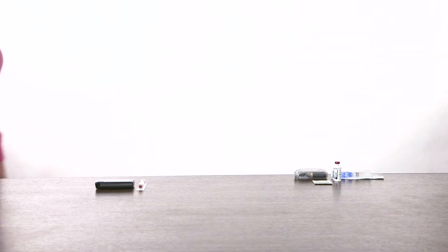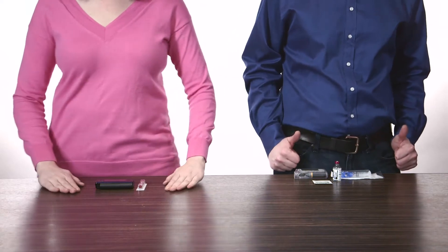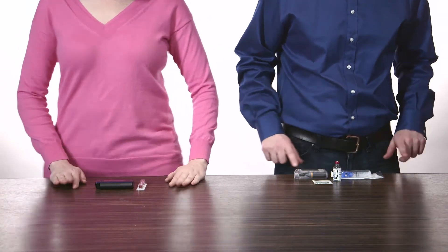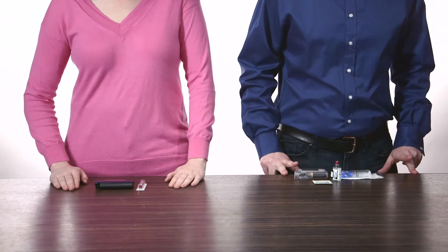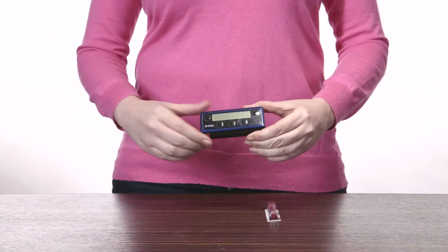So here's the situation. These two pump users have been arguing about whose pump has the faster and simpler insulin reservoir setup. So they want to do a head-to-head battle. On the one side, we have the Snap insulin pump.